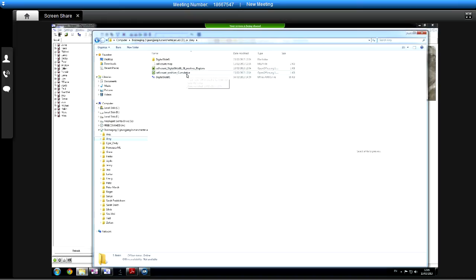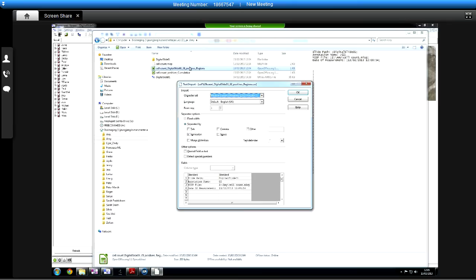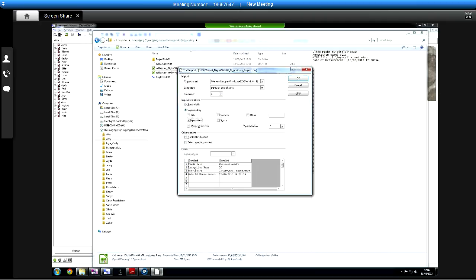has this computer got Excel or has it still got the 3D? Oh, it's still got the 3D. Okay, so these files that it generates are what are called CSV files, comma separated values. So it's a bit like an Excel file, but it's also compatible with a bunch of other software, stats packages and things. And they are semicolon separated. I think in a very recent version of Excel, for instance, it automatically detects that and sorts that out. Is this all fairly familiar in terms of data from other bits of software? Yeah, okay. So you see if it's not selected, it all just looks like a bunch of rubbish, and when you tell it that it's that, it puts it in columns, etc.